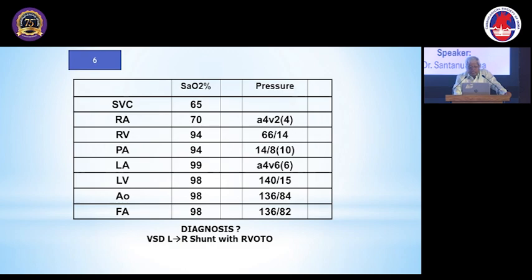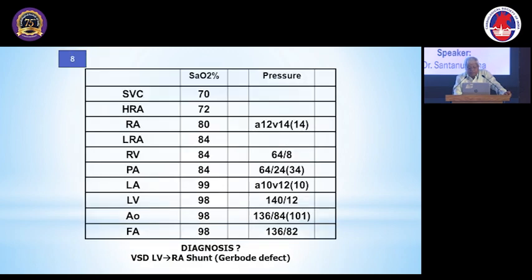One of you, this is again we are back to congenital. Yes, please, take the mic. Sir, this appears to be a case of restrictive VSD because there is a difference in pressure between RV and LV, and also, sir, there is a gradient between RV and PS. So there is a VSD with PS, sir, with a persistent left to right shunt.